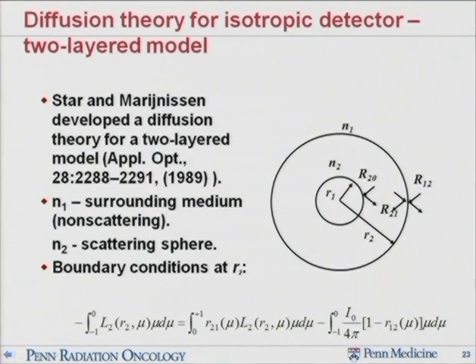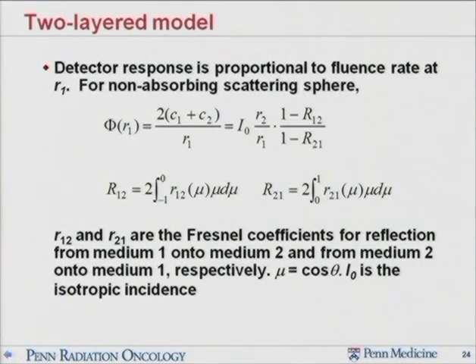So all this refracted light plus the transmitted light from outside. So you have to take into account the reflectance in this outer medium, and 1 minus that is the light that's transmitted into it. So this quantity coming into the fiber core plus the reflected fluence rate should equal the fluence rate going in these directions. And that boundary condition will allow us to calculate very simply. It's basically a finite element model of the diffusion model of these two boundaries. And the final result actually is very simple.